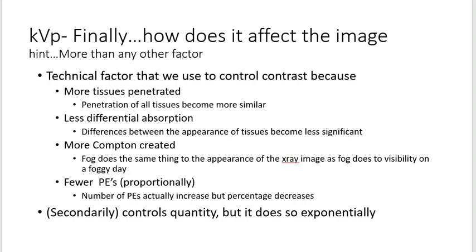You can make a comparison to a foggy day if you're driving to school or to work or around town. It makes it very difficult to see the trees, that cloudy appearance makes everything blend into where you can't see very well. So you don't see the contrast between the woods and the trees and the road and the grass and all that stuff. Very similar.